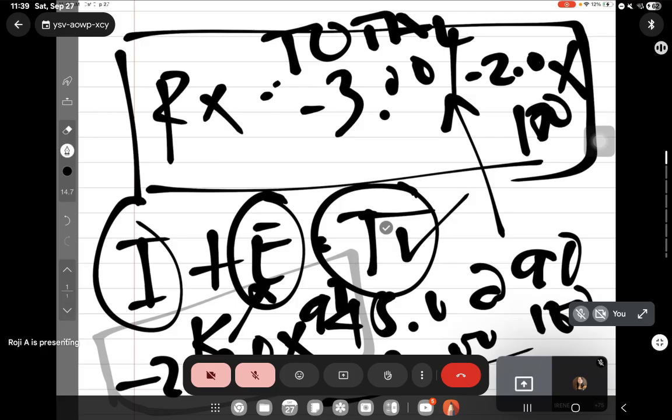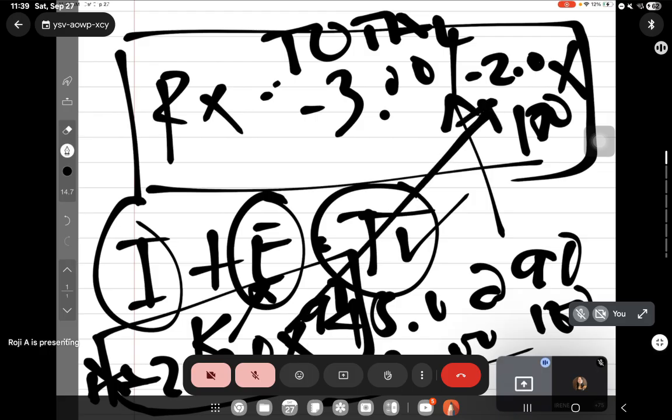So now the thing you need to do is correlate your K reading, the corneal astigmatism, with the total astigmatism of the patient. Are they the same? You said the total is axis 180.